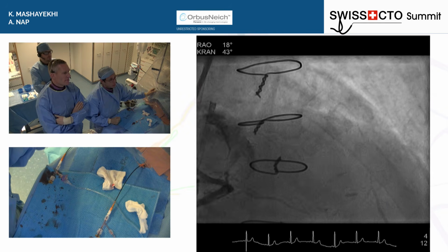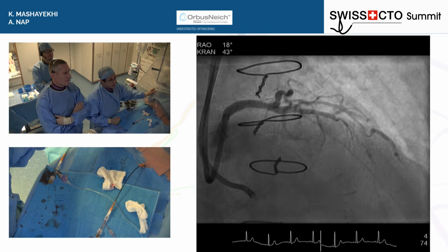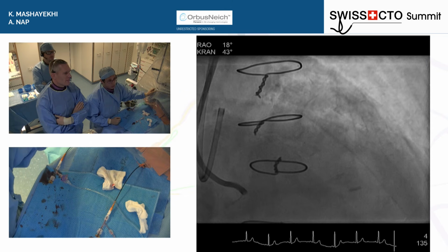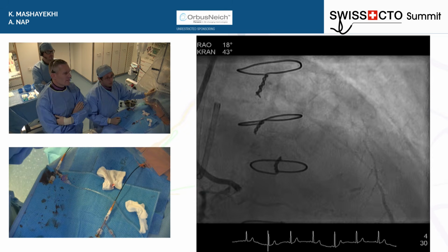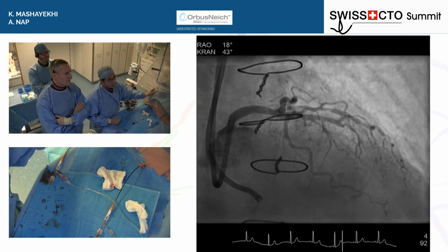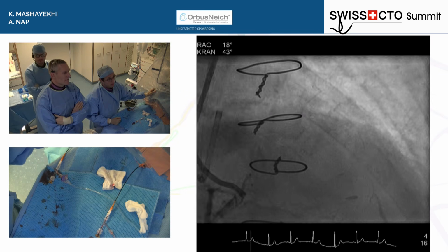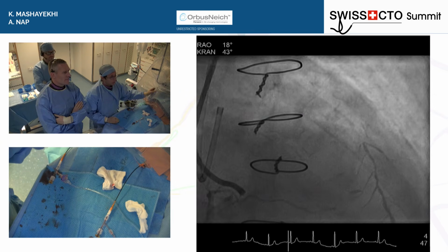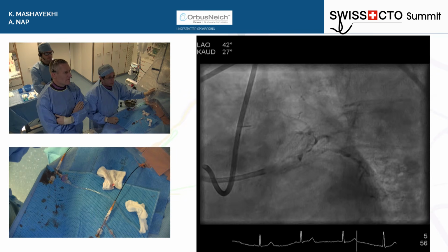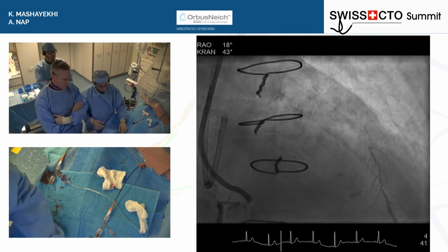So we changed projection, as you can see here, and then we have to say, indeed, this is more than 20 millimeters, because we thought it's a functional occlusion and very easy and fast forward, but it's never easy, especially as a post-CABG patient. So I think these are the setup shots we did. We did a spider view also, but it didn't give us any information here. And so therefore, we can open the discussion.